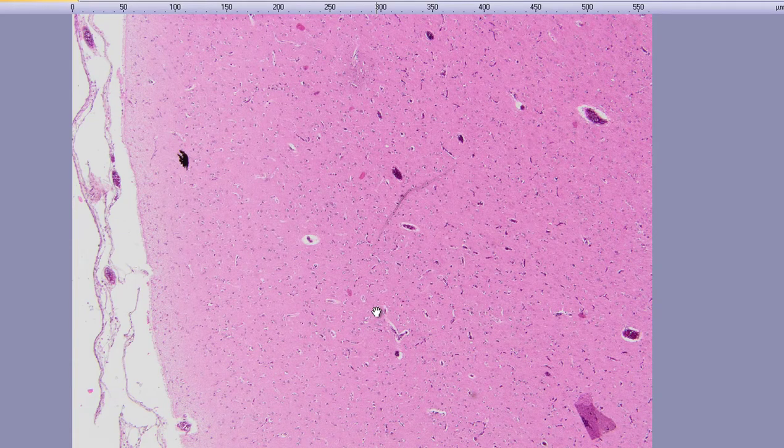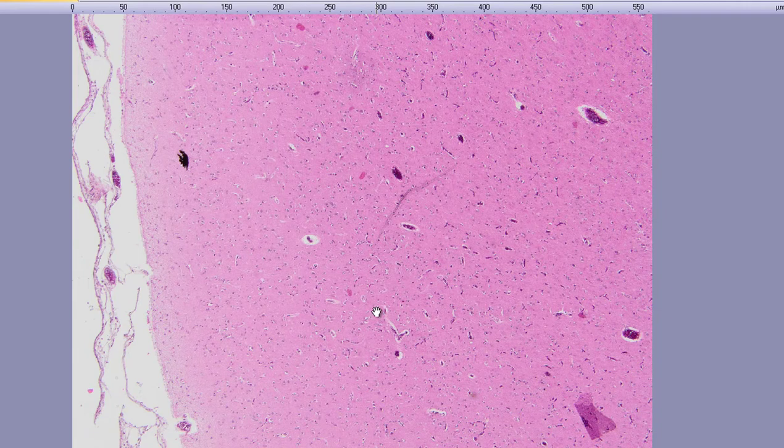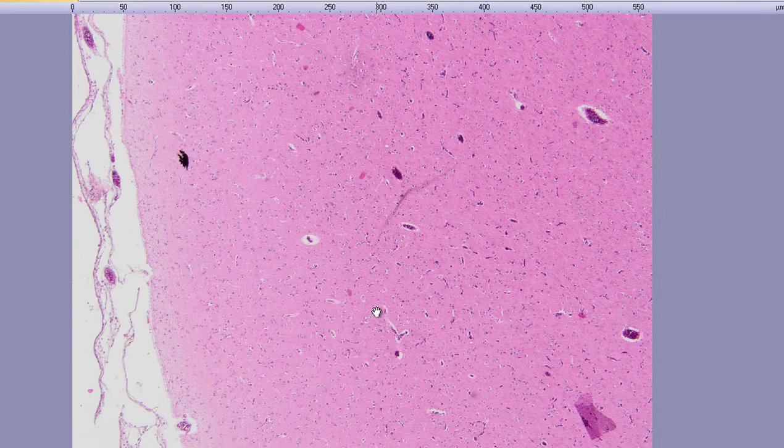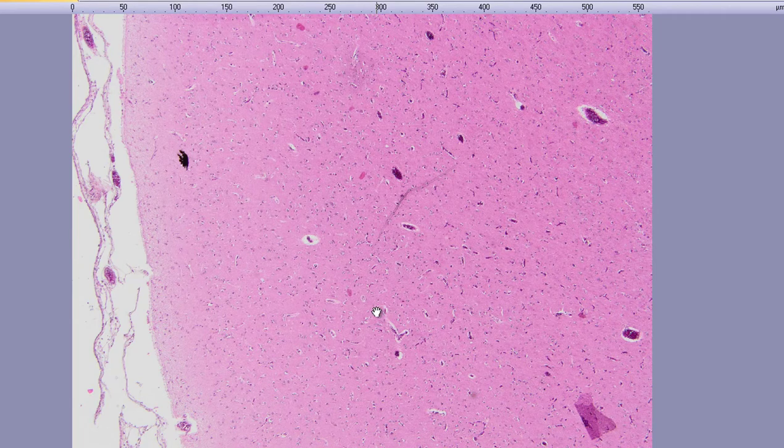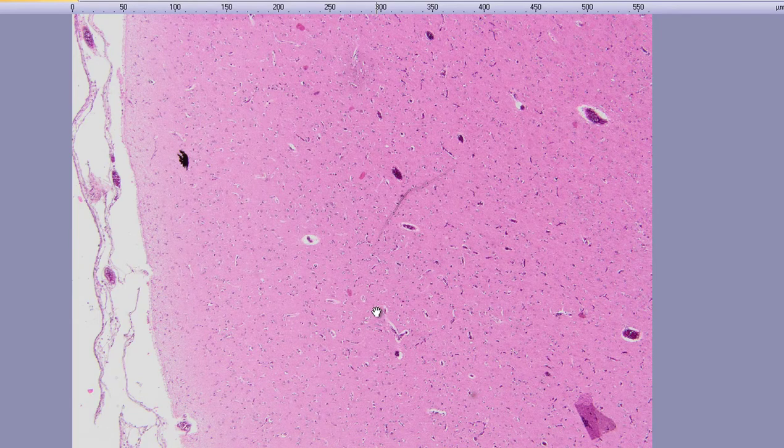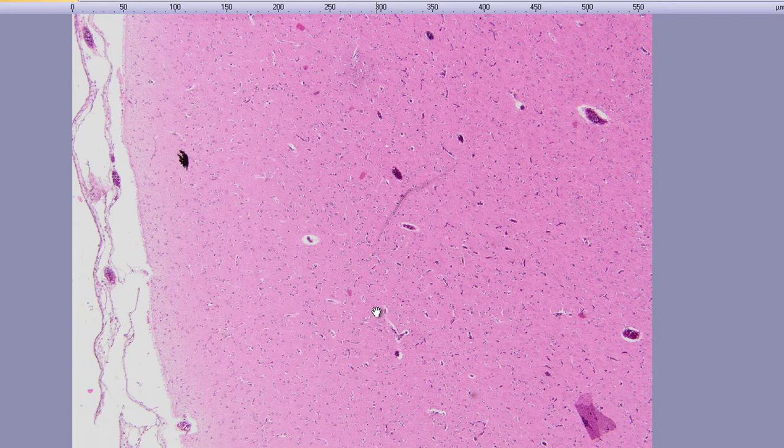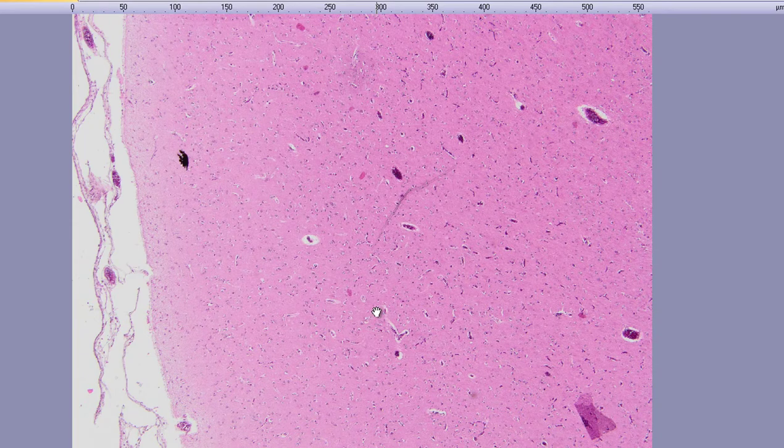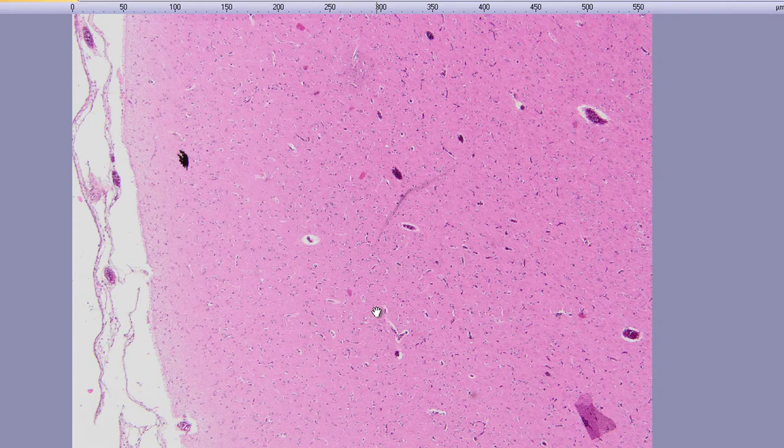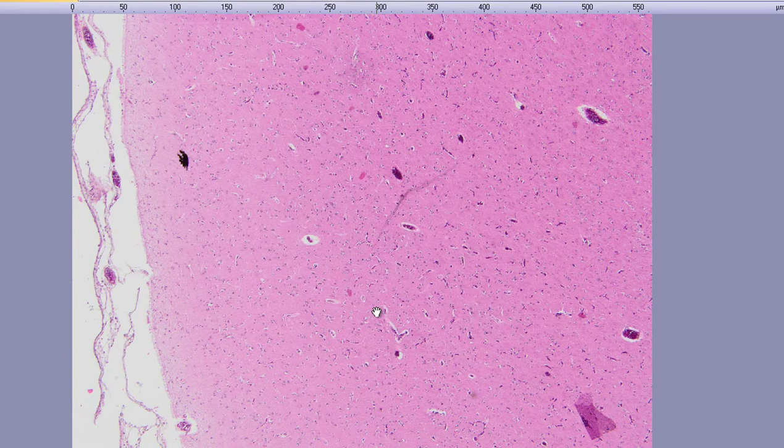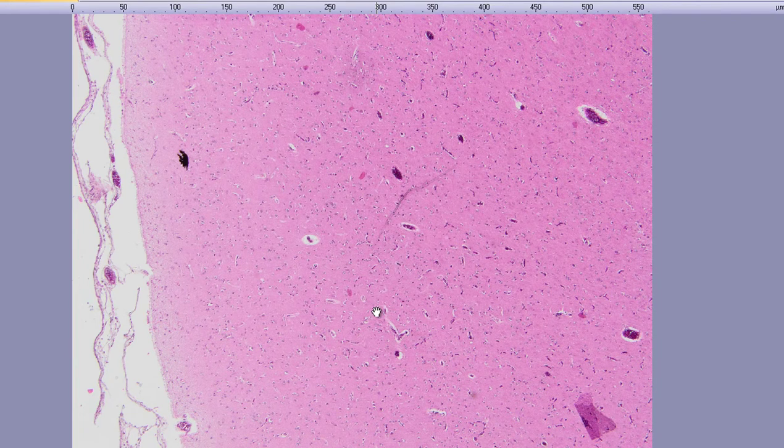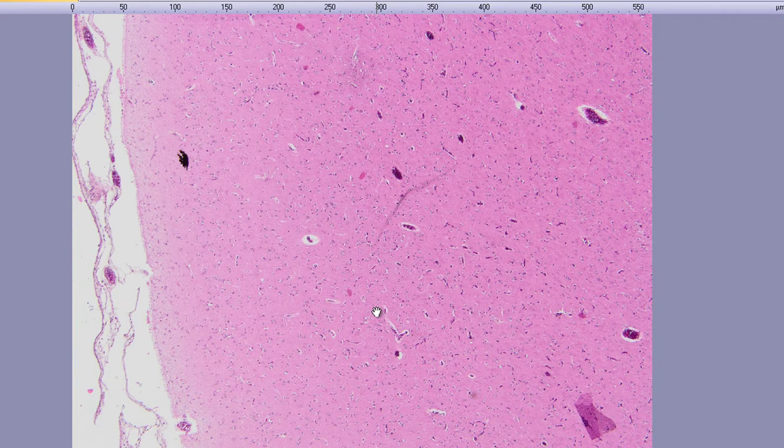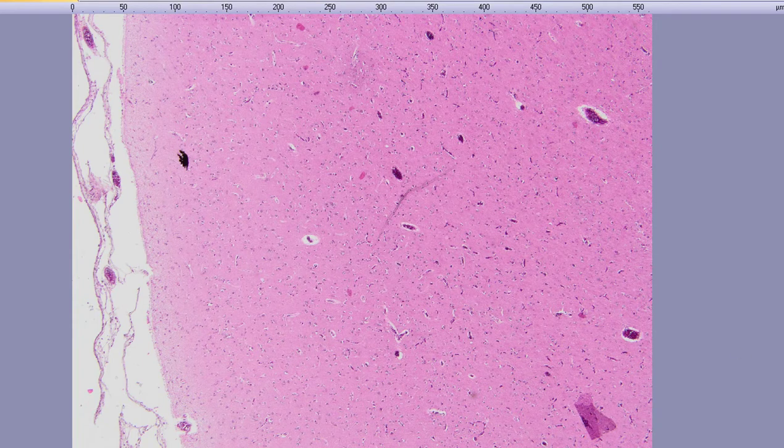Then she develops neurological symptoms and due to neurological deterioration she is referred to our hospital. Computer tomography of the brain reveals multiple contrast-enhancing lesions, but the patient is lost soon afterwards and brain autopsy is performed. We are going to be looking at the sections from the brain autopsy.